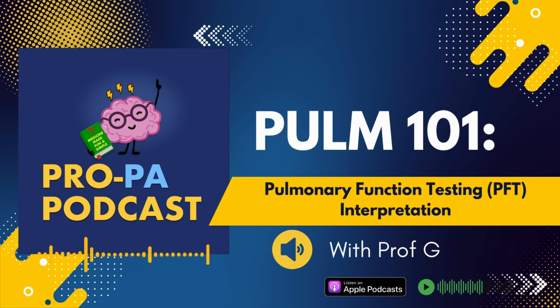If you said C, idiopathic pulmonary fibrosis, you are correct. This is a restricted pattern. We see a normal FEV1 to FVC ratio and a low TLC. We also see a reduced DLCO, and this is consistent with pulmonary fibrosis.